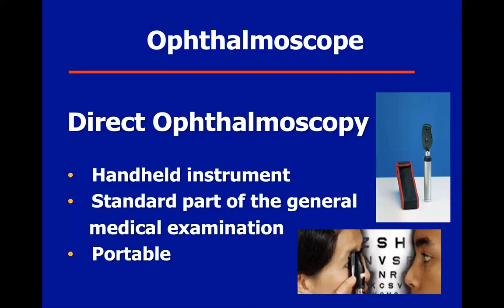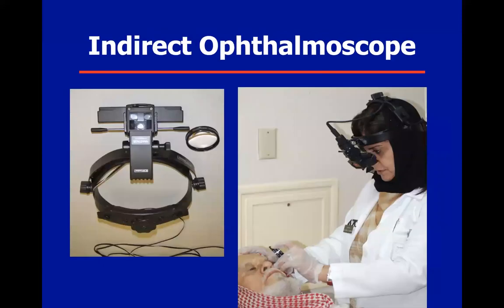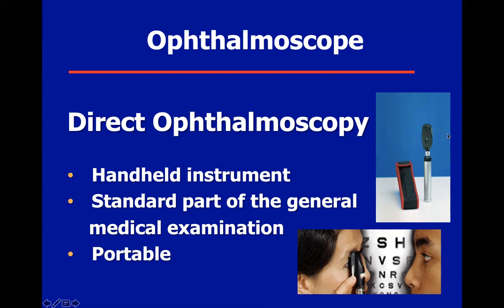The nice thing about it is that it is portable. If you, as a fifth grade medical student, haven't mastered the ophthalmoscope, then you have honestly failed your course, because you do have to know how to use it. And you will be having tutorials, hopefully when you get to the 5th year, on the proper use of the ophthalmoscope. We, as ophthalmologists, don't really use the direct ophthalmoscope. We leave it to the non-ophthalmologists.